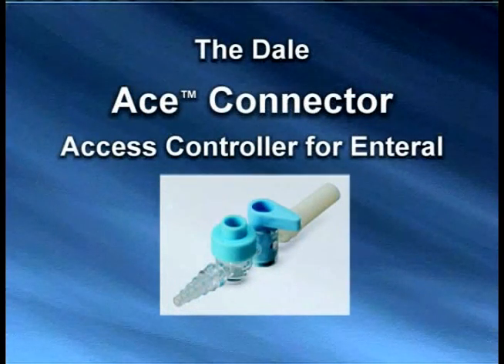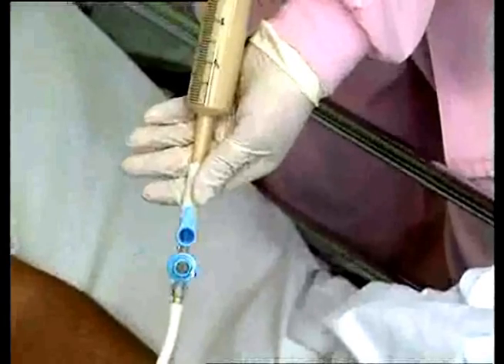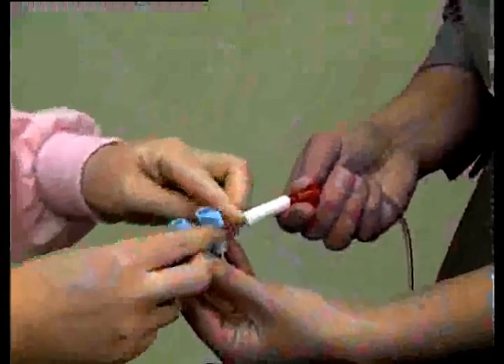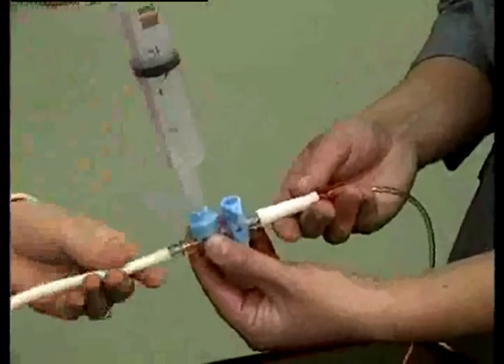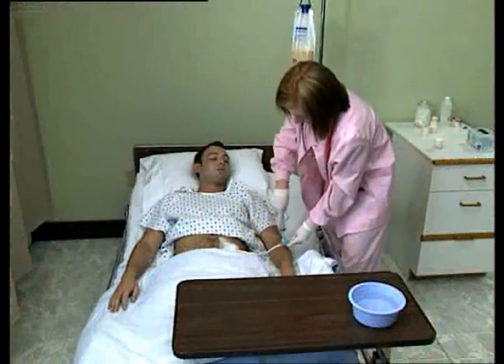The Dale Access Controller for Enteral, or ACE Connector, is indicated for controlling fluid flow into and out of medical tubes, while providing for the delivery of enteral formula, syringe irrigation, and liquid medication, without breaking the fluid delivery lines for up to 30 days. This 100% closed system protects the health care worker from accidental exposure to the patient's gastric fluids.